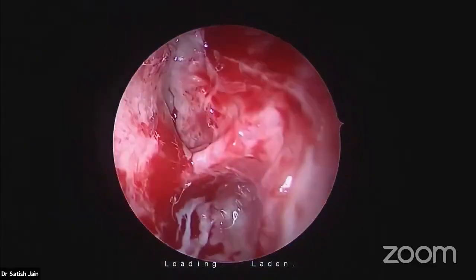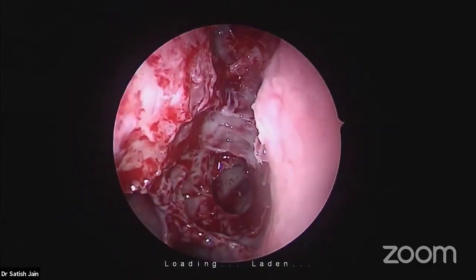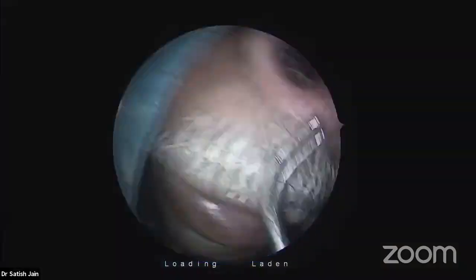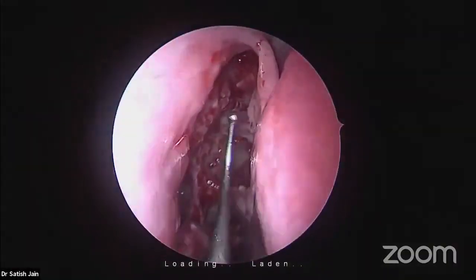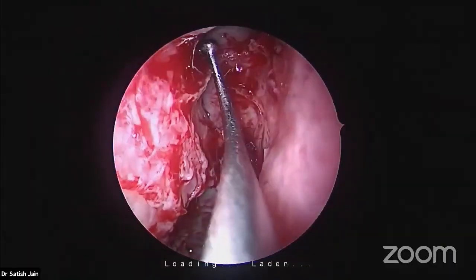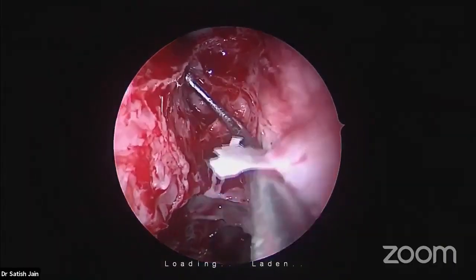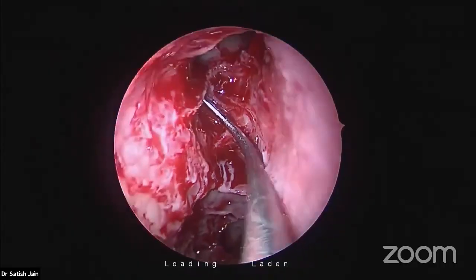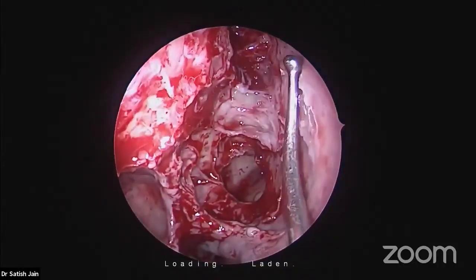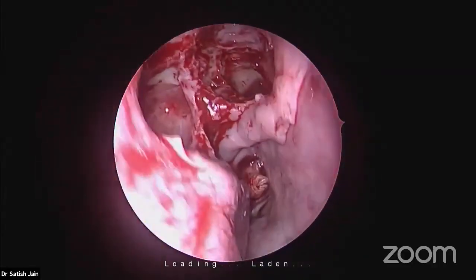Now see this recess. This recess, it was shallow on this side, posterior to the frontal sinus, that is supraorbital. It is more deeper on the other side. See this. This is the frontal sinus, and behind this a recess going up above the orbit. This is very shallow. This is supraorbital. Not very important on this side. So this is about the full house FESS on this side.